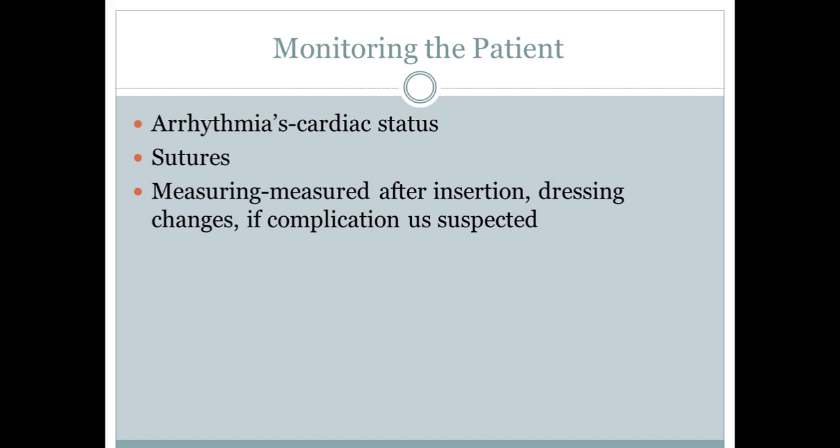I personally have had this experience, but I only seemed to notice it with manipulation, like when my PICC line was being flushed with saline. I don't know if it's because the nurse was flushing it too fast, but anytime they would flush it, I would all of a sudden feel like my heart was beating out of my chest, and my rhythm felt so irregular. It was the most bizarre and very unsettling feeling. So when you go to flush it, we'll teach you how to flush it in a pumping motion, but you might want to go slowly.